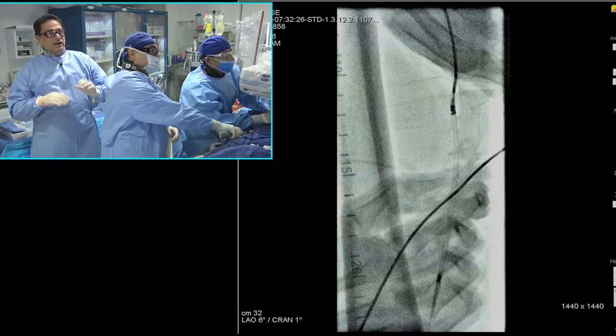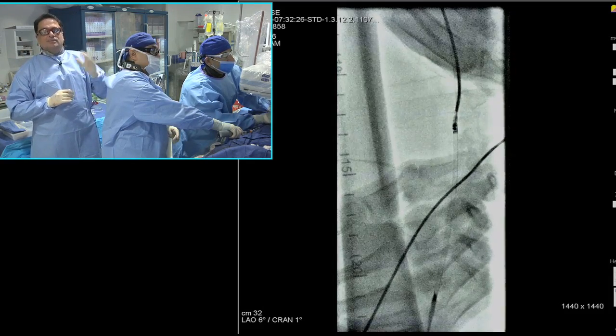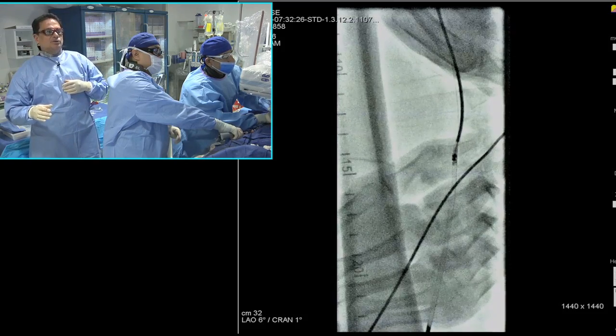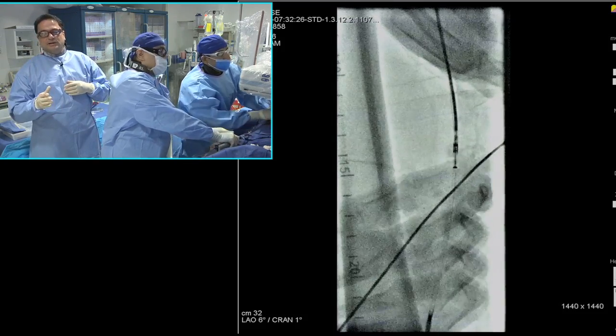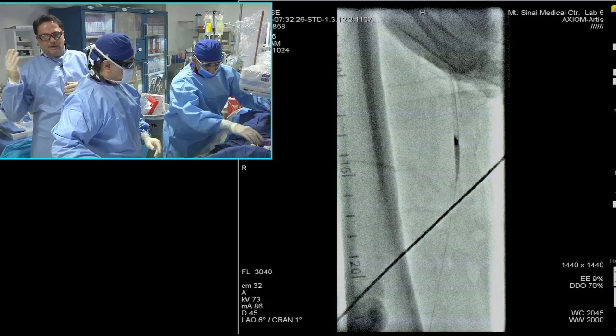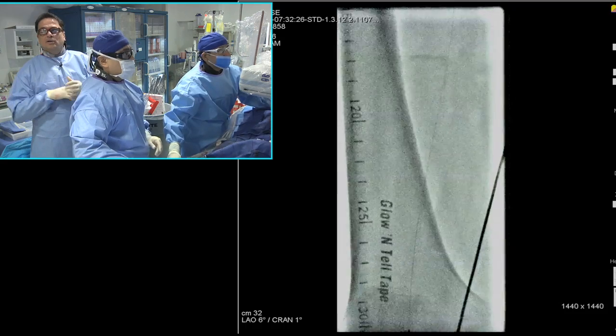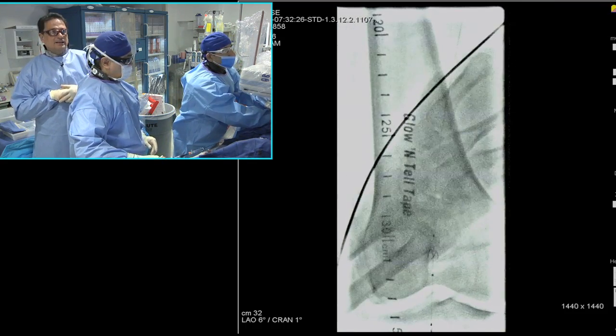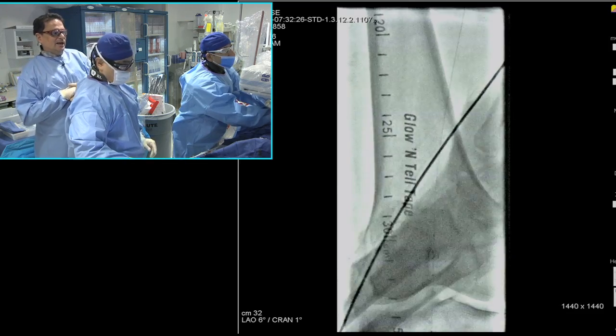or DCB. If you're going to DCB this entire segment, there's no need for intravascular ultrasound. If you're going to leave it with standalone Silverhawk, then I think you should do intravascular ultrasound to ensure that you don't have adventitial or medial disruption in order to be able to reduce your restenosis rates. So I think that was a very valid question that I had by somebody.